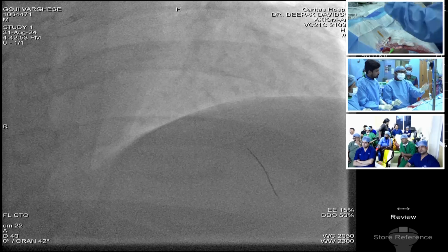Flow is not bad. Well, I think we'll just wire it by this.